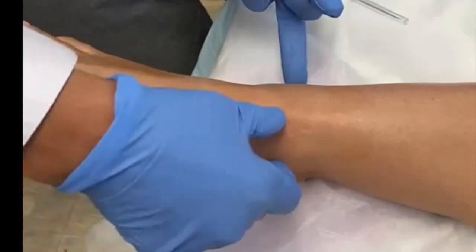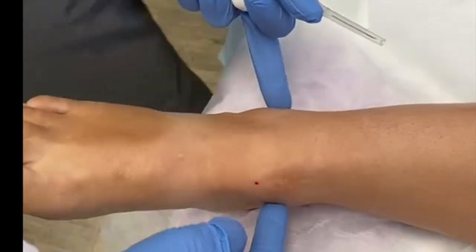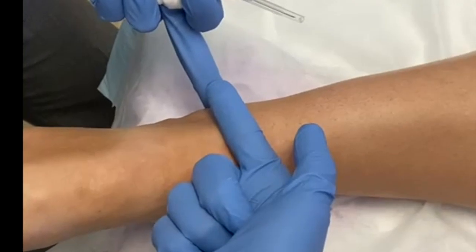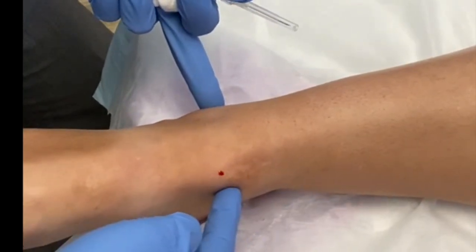This is the medial malleolus, and if you turn the foot around, this is the lateral malleolus. The ankle joint is approximately 20 degrees, pointing from the medial malleolus to the lateral malleolus — so this is the ankle joint.